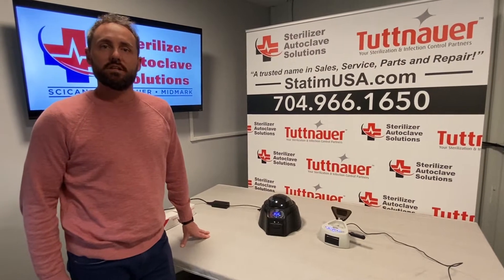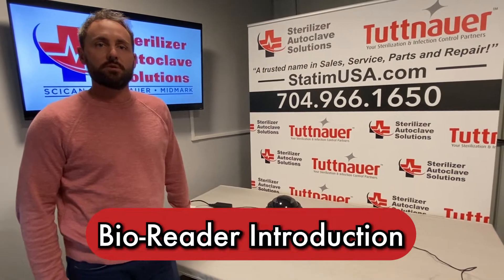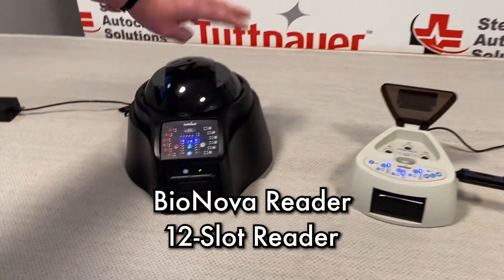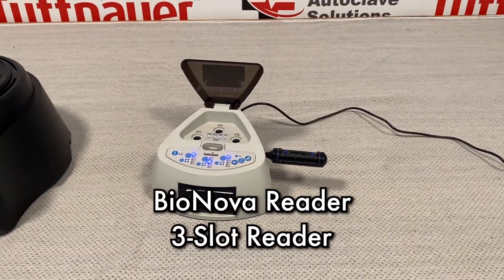Hey everybody, this is Dave with Sterilizer Autoclave Solutions. In this video we're going to talk a little bit about the biological readers available through Tuttnauer. There are two readers available: the first one being a 12-slot Bionova reader, and the second one being a 3-slot mini Bionova reader.